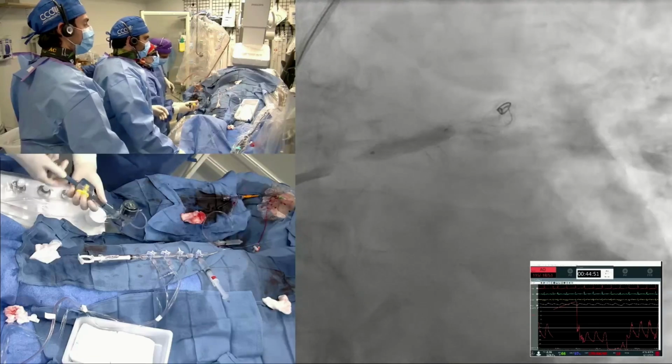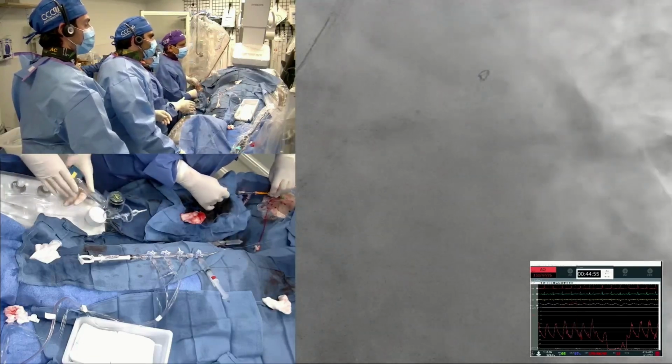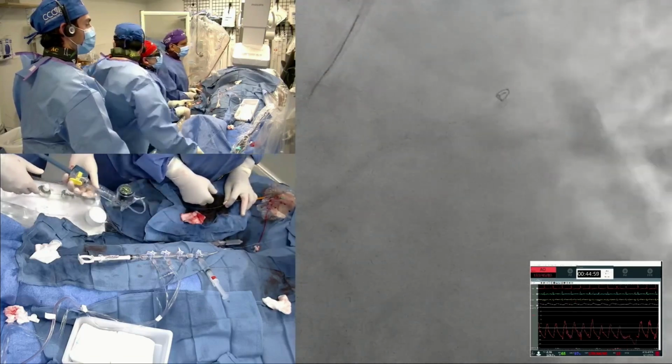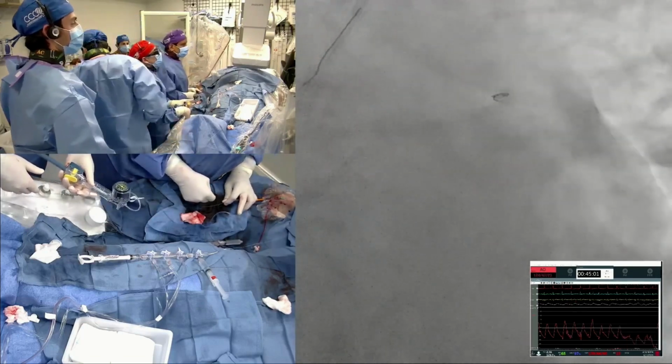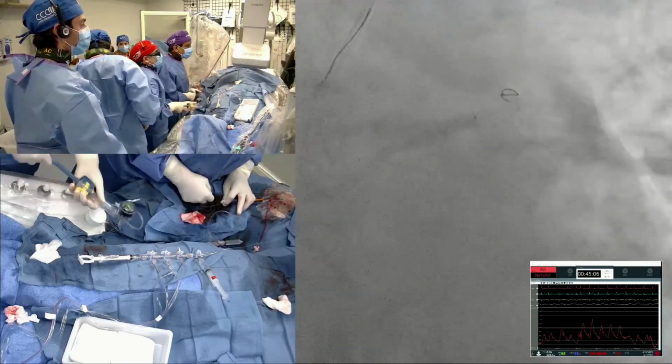I think the balloon that expanded or didn't expand in one spot really told you a lot if you're going to come back different. And I think that really was the marker. And then you can do whatever you want with imaging, but you still have to respect the old time balloon not opening up if you're going to do a bifurcation stent in the left main.